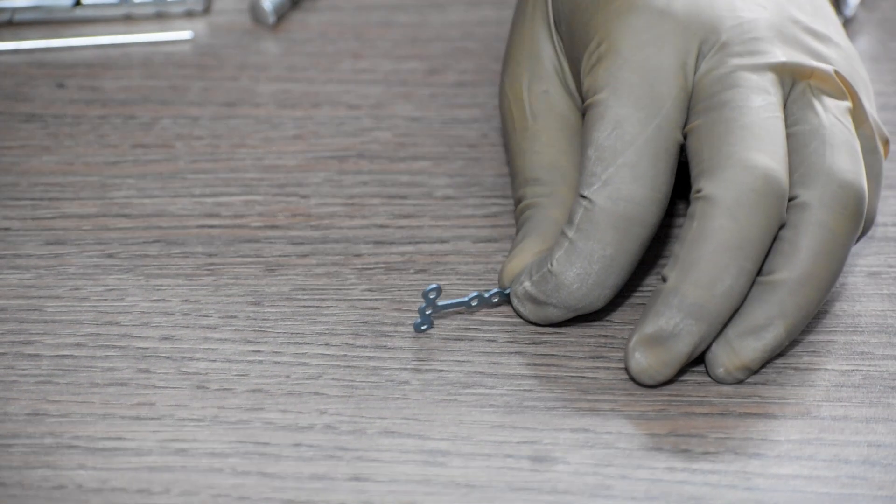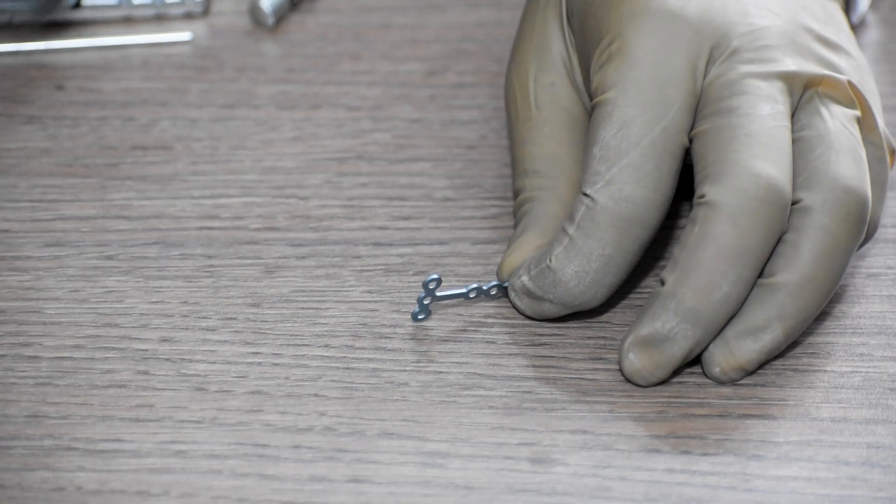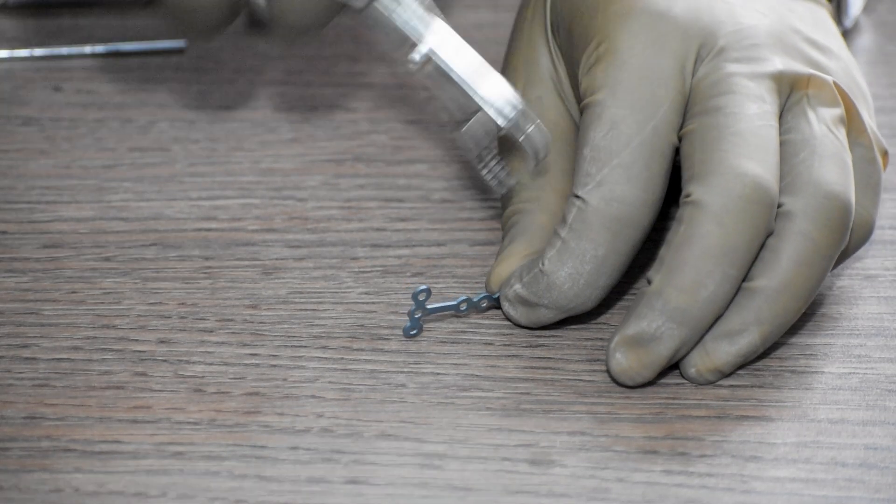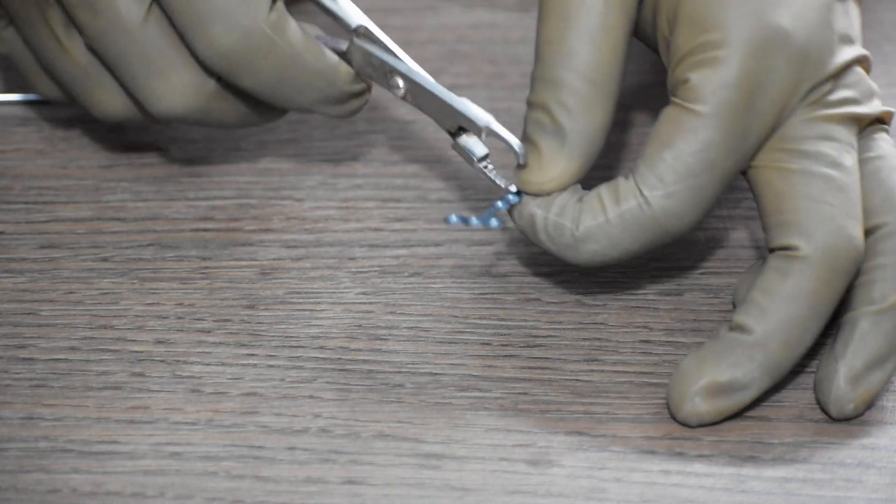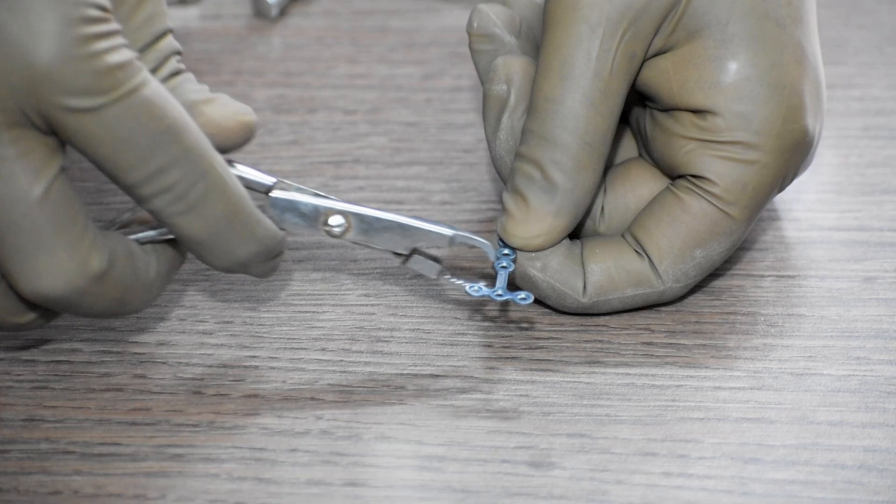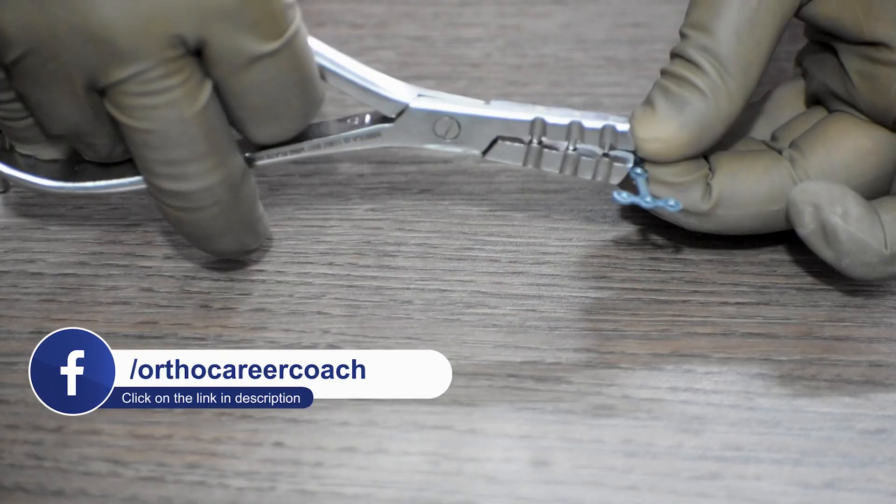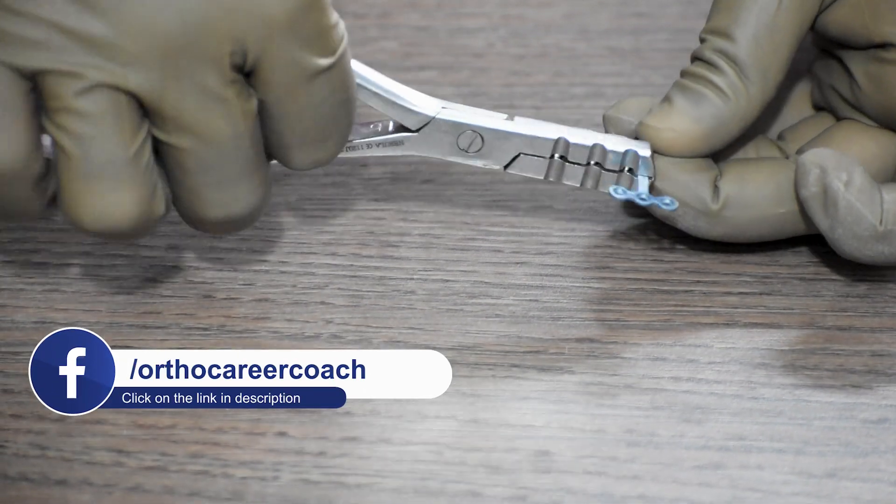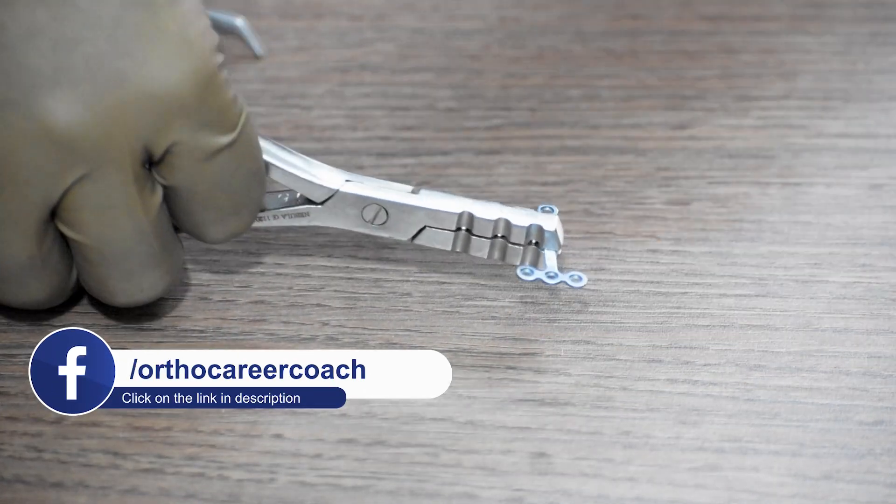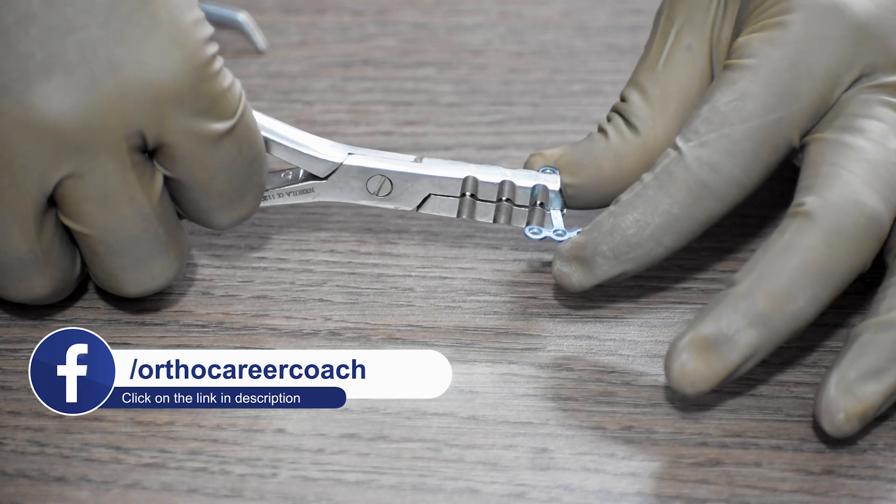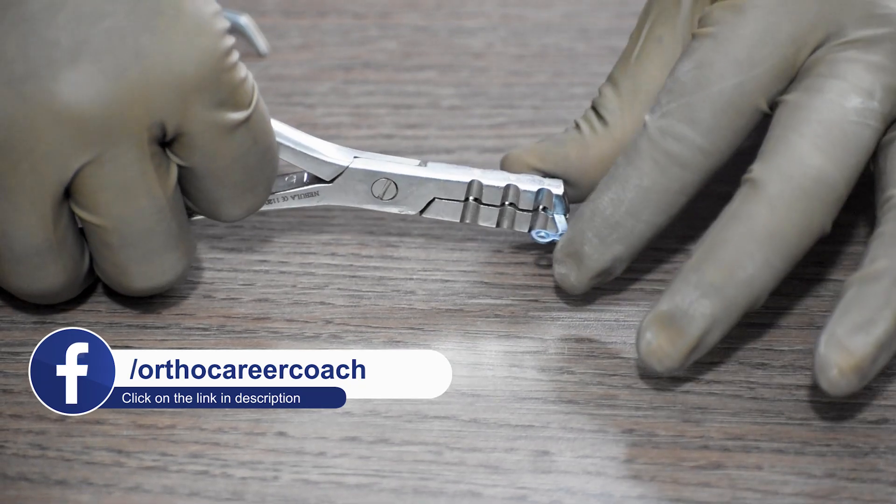Or we can use the plate holding forceps in order to hold this plate in the fracture site in the radial head. Thereafter, we will use the plate bender if required in order to bend the plate to fix the fracture.